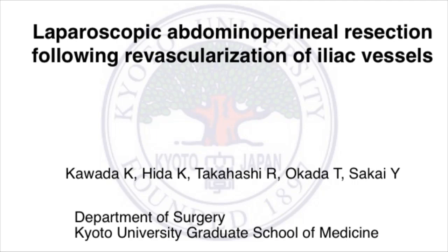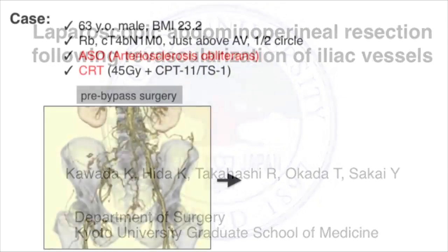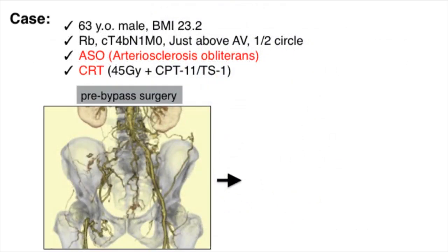Here we present a case of laparoscopic abdominal perineal resection following revascularization of the iliac vessels. The patient was a 63-year-old man with low rectal cancer located just above the anal verge.